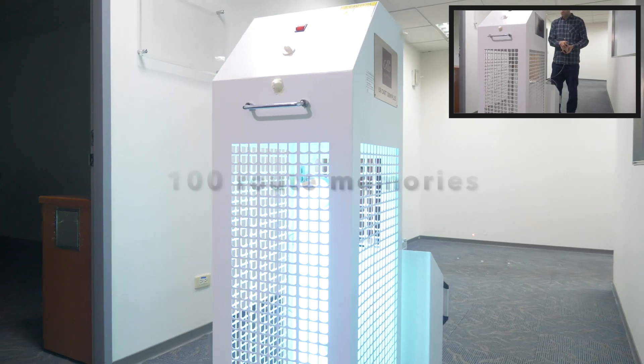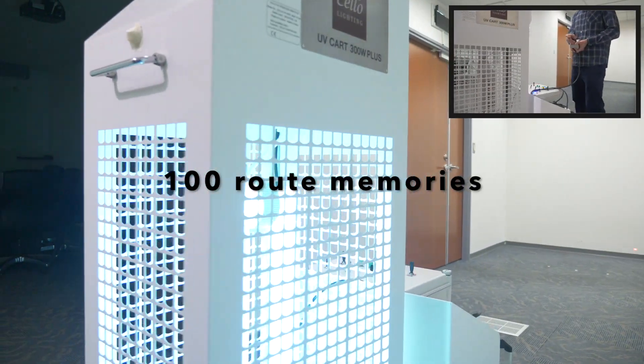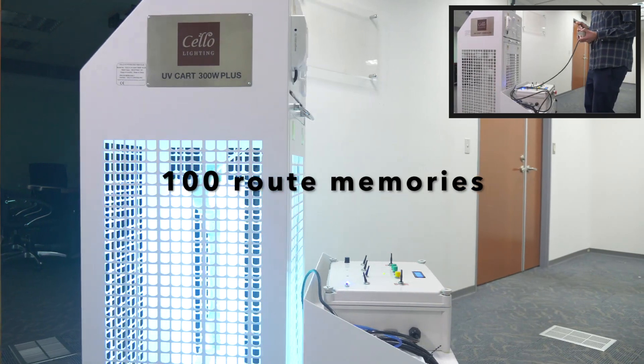In total, the Cello UVC robot can memorize up to 100 disinfection routes, with no limit on the length of each route.